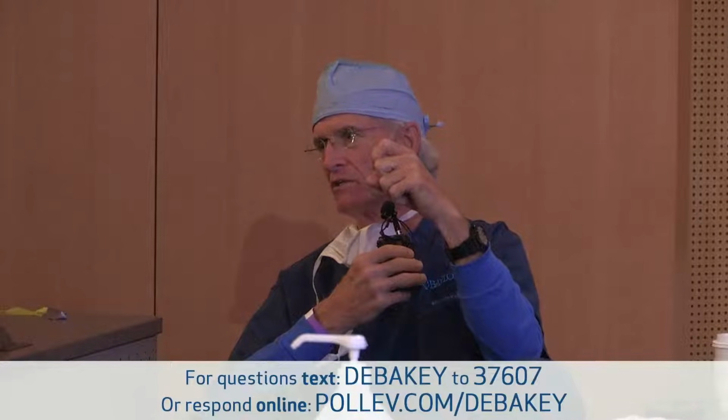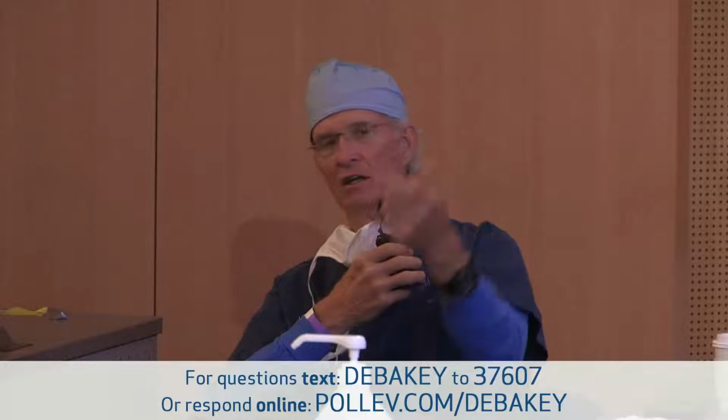That's basically the little shepherd's hook with multiple side holes. It's convenient because then you've already got a reverse curve catheter in place to catheterize the opposite side. So what I try to do is, you don't actually have to point the shepherd's hook towards the opposite wall. Sometimes you can have the shepherd's hook pointing towards your ipsilateral access side, and the wire will kind of bounce off the ipsilateral wall of the aorta and get into the proximal common iliac. Once I've got a few centimeters of wire into the contralateral common iliac, then you pull your reverse curve catheter and wire together down.